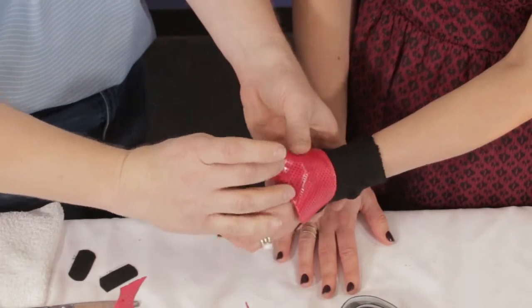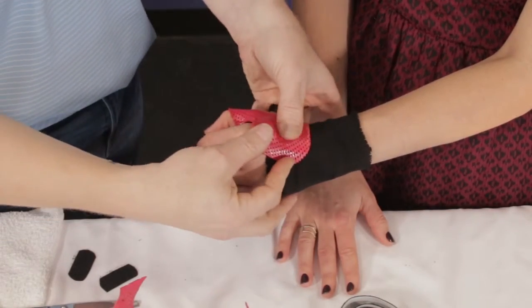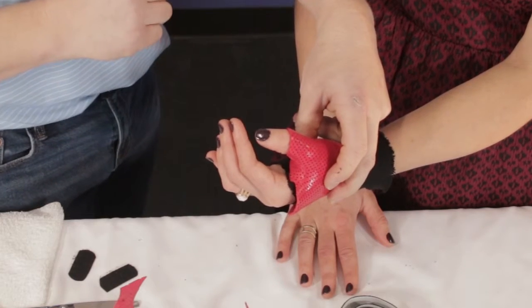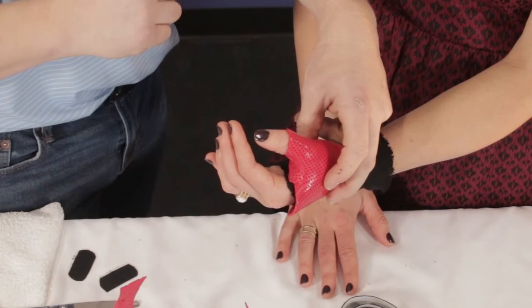Slide back on. This supports the CMC joint and MCP joint, with the IP free. We'll roll that in the heat in just a little bit. Let's see what finishing the splint looks like.